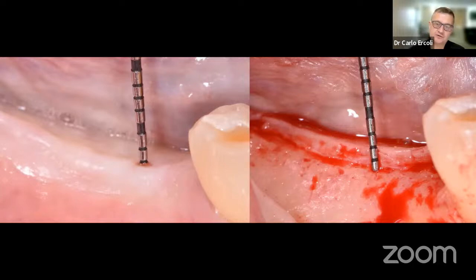And realistically, if you look at this, it is a combination between some soft tissue in the thickness that you have and a potential resorption of the crestal bone that you might have. By the way, these measures of 2 millimeters roughly are very common in many other areas of the mouth. In fact, we're currently doing a study to map, in a fully edentulous patient, the thickness of the soft tissue in a number of individuals. We have a clinical study that's about to come to conclusion.